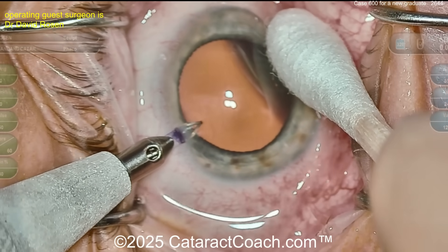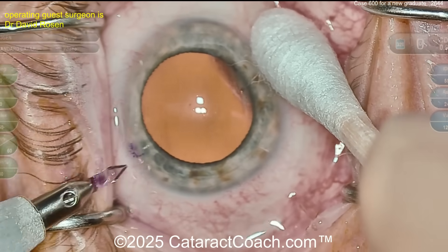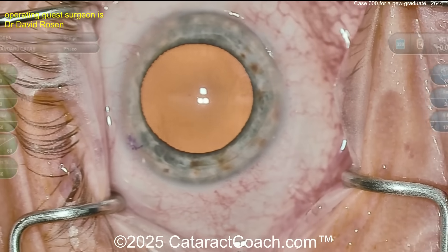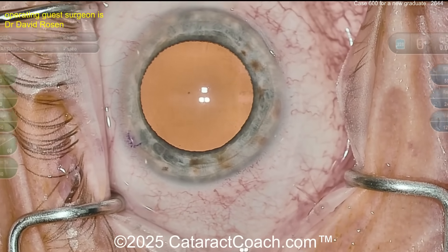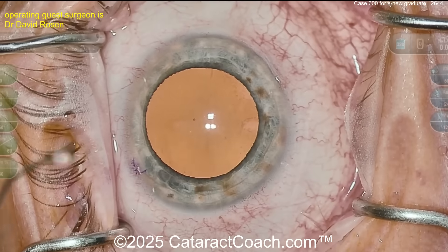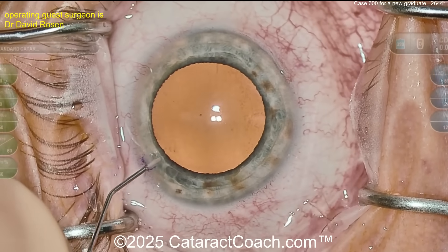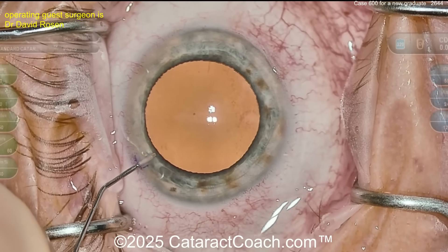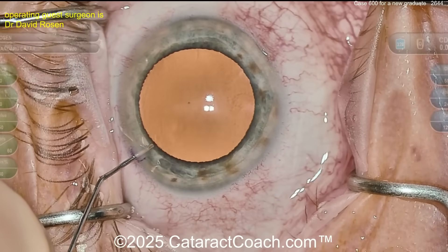Here comes a side port being made — interesting, a little bit of ink placed on the diamond in order to help stain the paracentesis; that can help. I'm too cautious — I don't touch my diamonds, I wouldn't put ink on them. The incision's there now. Looks like some anesthetic going in. Good draping by the way, eye in primary, I like the microscope settings — nice clear image, good picture.